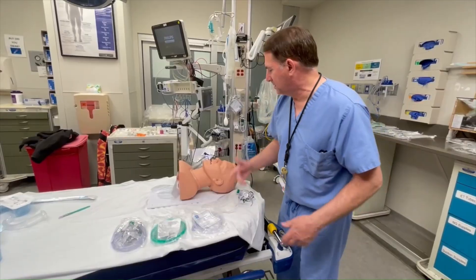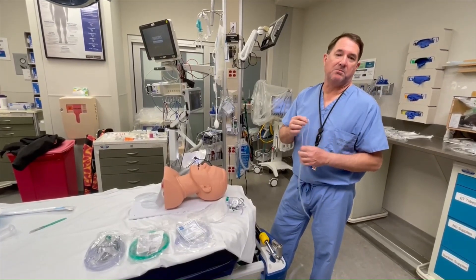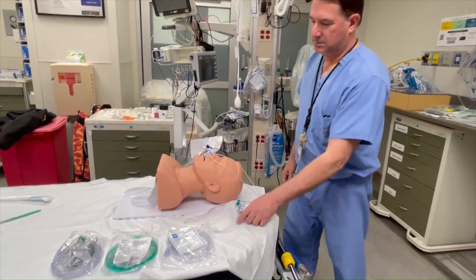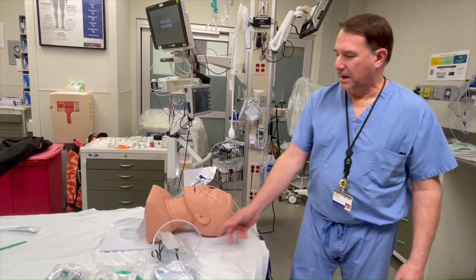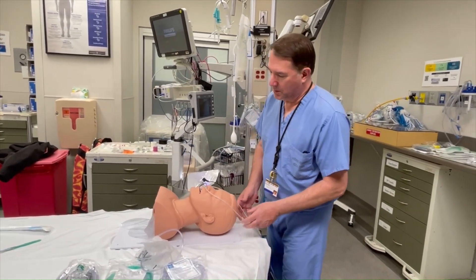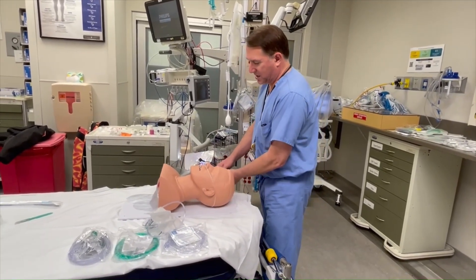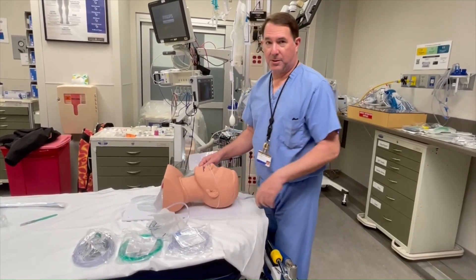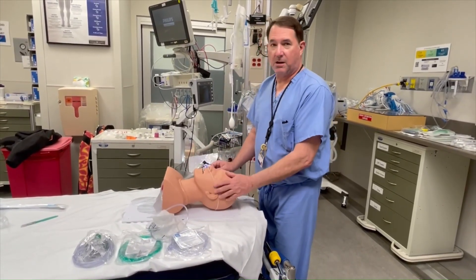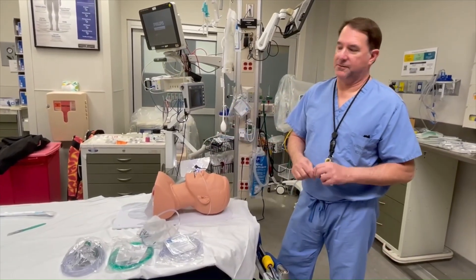Whether you choose this or that, you're going to put the cannula on. For the respiratory therapists watching — I'm not going to bore you with how to put a cannula on, I'm just going to show you what is not acceptable. That's a no-go, and it happens quite frequently — we're watching all the videotape of these resuscitations. The best way is to put it behind the patient's head and cinch it up. If you loop it under their chin and they've got a C-collar on, the minute you pull the C-collar off, everything falls off. If you cinch it behind their head, this is a fail-safe — it works every time.